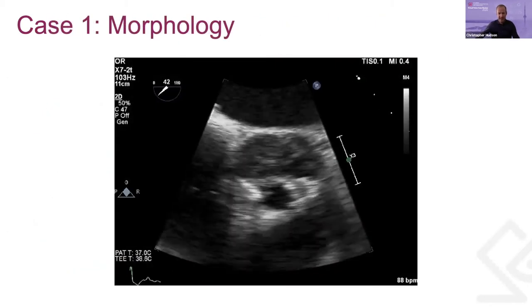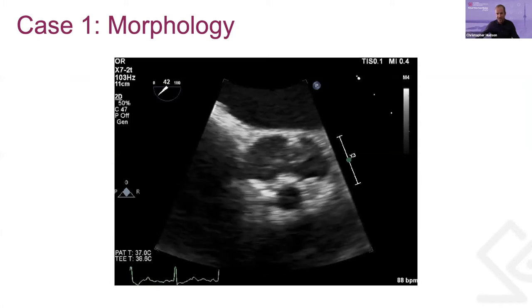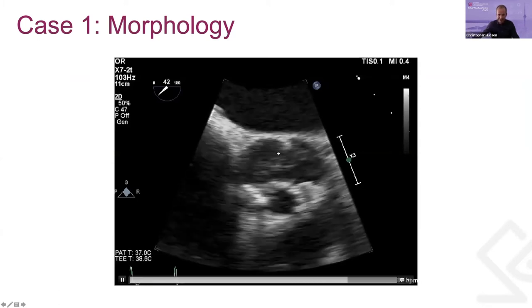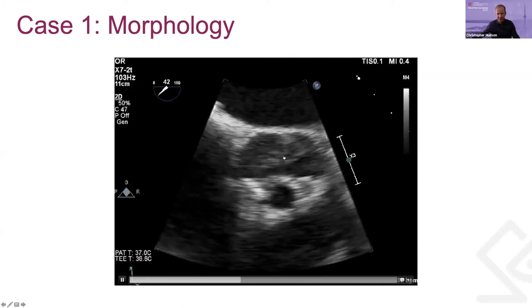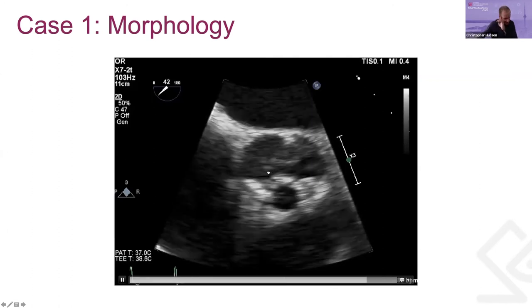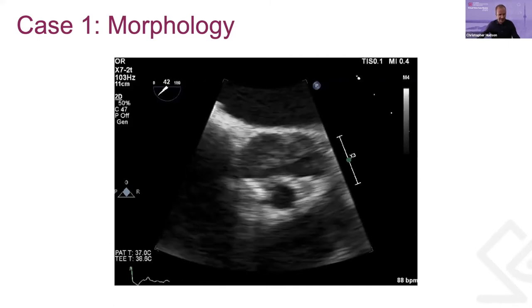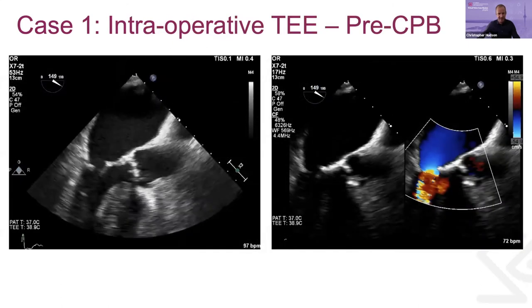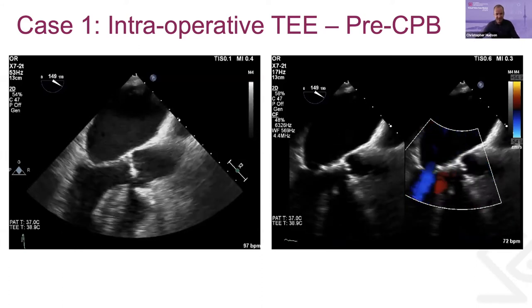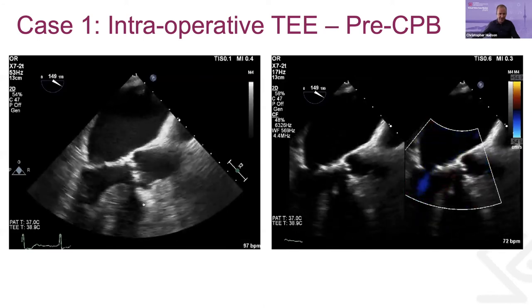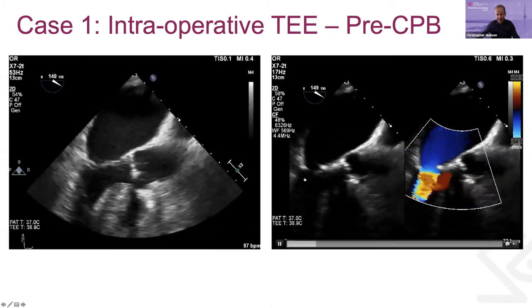Continuing on to this exam and back to that previous image — what does this valve look like? Is it rheumatic or calcific? From its appearance, it looks like it has three leaflets. They're not moving very well, and it looks more like a stellate-like appearance, so this is calcific disease. Looking further, there's no evidence of mitral valve disease. Moving on, this is a long axis aortic valve with color comparator showing a heavily calcified valve with some shadowing distal to the aortic valve, and there's a little bit of mild aortic insufficiency.